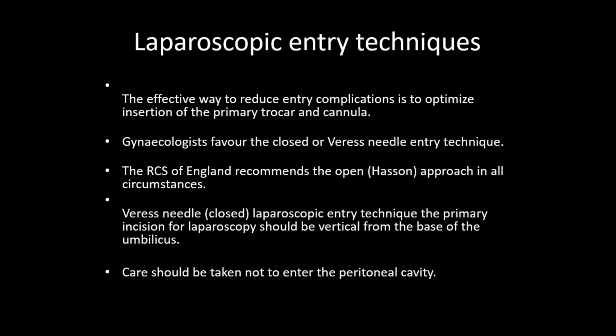The entry as well as the exit of the port should be under complete vision by your primary port camera to avoid a major and very common complication, injury to the inferior epigastric artery. The inferior epigastric is running at this point actually, and it's a branch of the external iliac artery. The bleeding will be horrible, a severe bleeding, and sometimes it requires turning the patient to a laparotomy. So, under vision, either insertion of the port or extraction of the port after finishing your procedure.